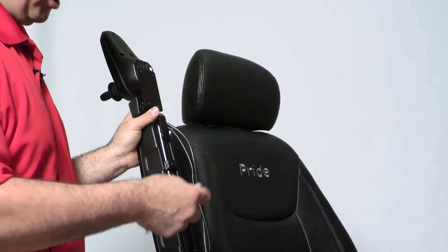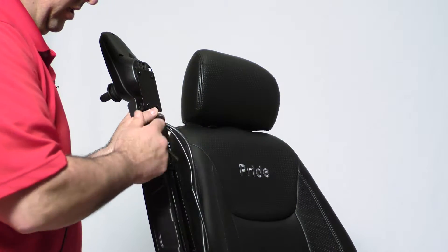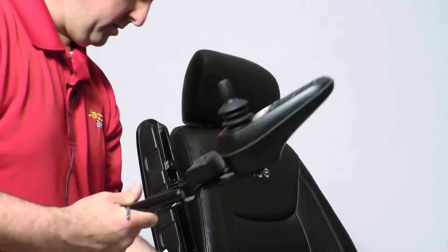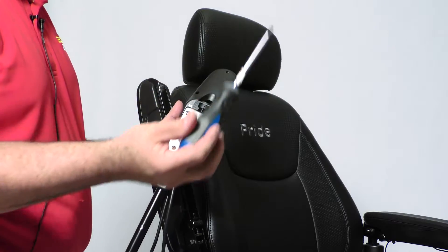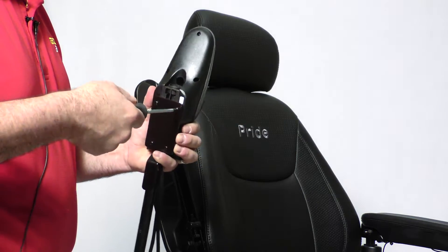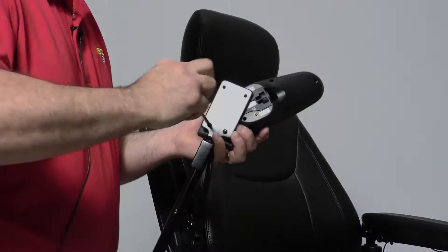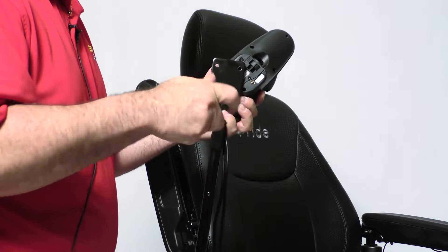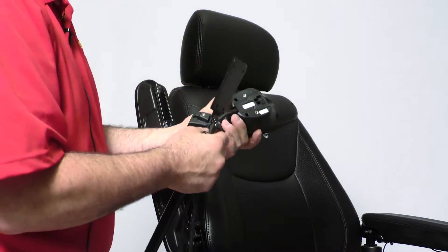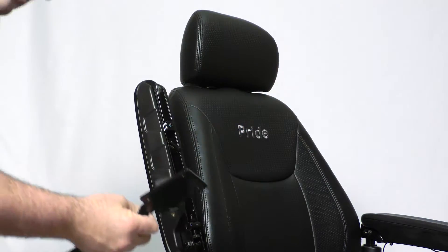Take your M4 Allen wrench to the set screw and loosen it up, and remove your inline mount for your joystick. Take your number two Phillips head screwdriver and remove your joystick from the inline mount. And loosen up the two Phillips screws that hold your light switch in place, and now remove your joystick from the mount.